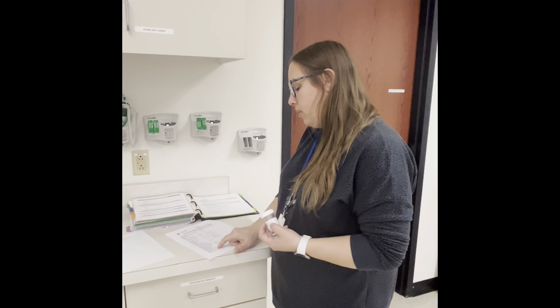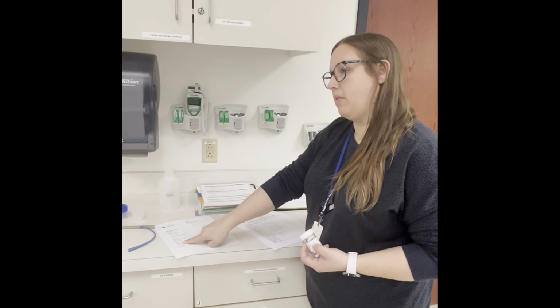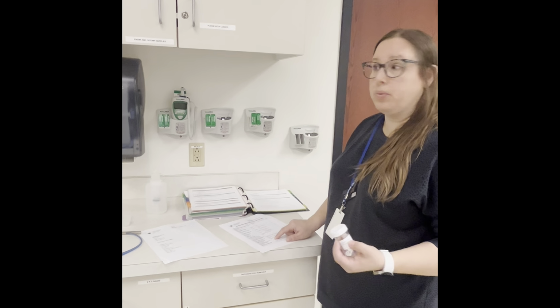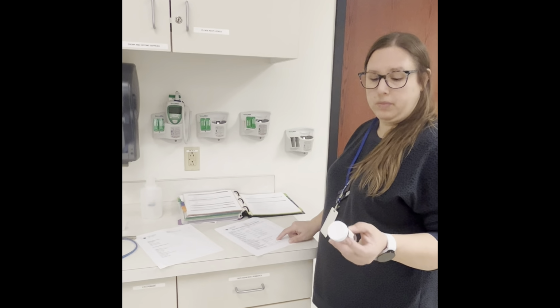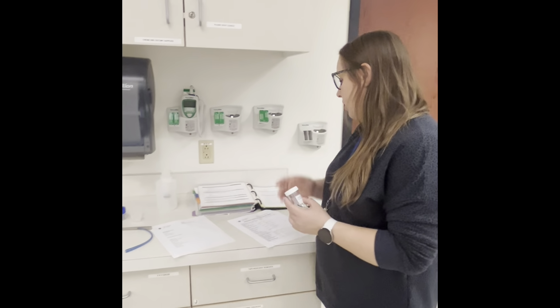Hold if apical pulse is less than 65, so we need to go back and check what is our pulse. So the pulse on this one is 71. We're going to give it by mouth, which is true. We're going to give it through the tube though, and we're going to give it daily now. Our expiration is 12 of 2029, and that's great. So we have that.